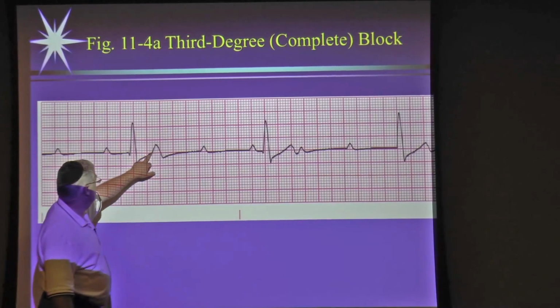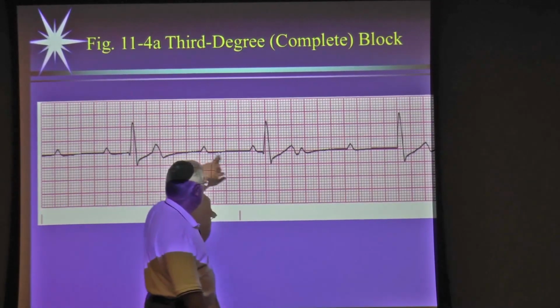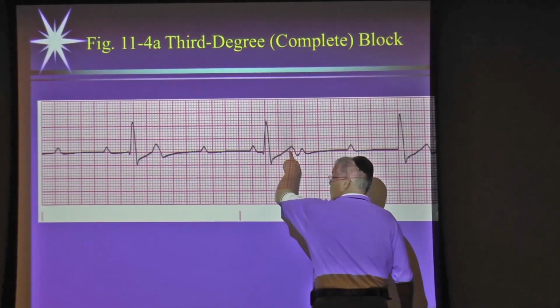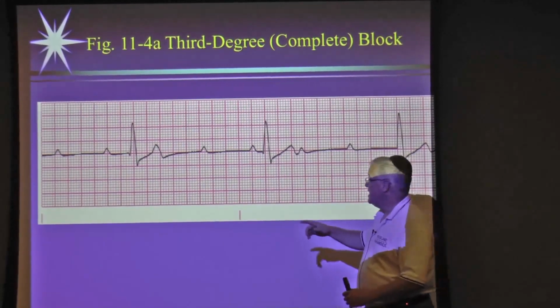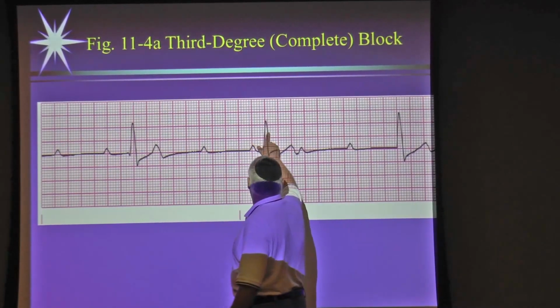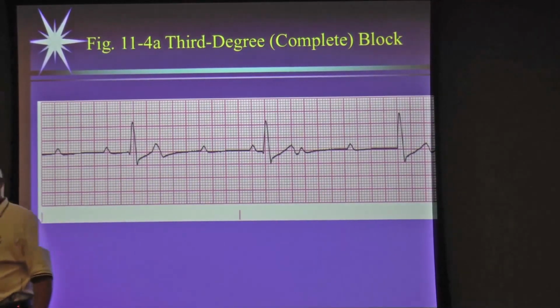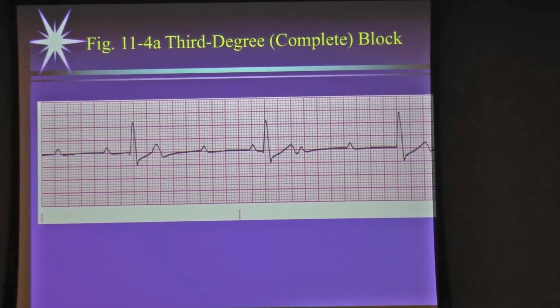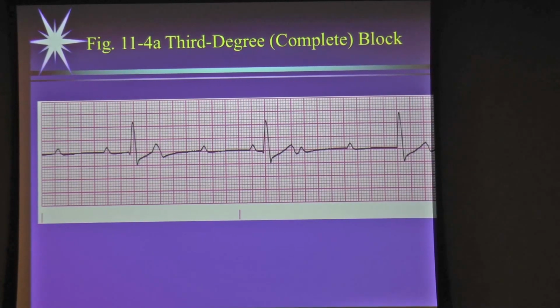So if you looked at this T wave, whatever we're going to call it, P wave, it's much higher amplitude than this one. Why? Because you have two things occurring simultaneously. The same thing like if you mapped out your R to Rs. You got one here, here. If you had calipers that stretch that wide, you would see that your R to Rs are regular. Why? The ventricles have no idea the atrium are firing, so they're firing on a regular basis.